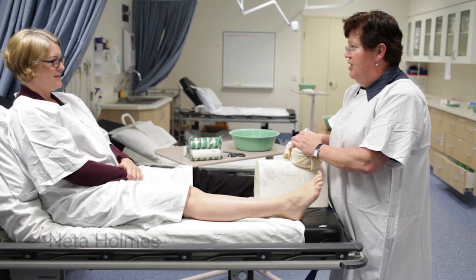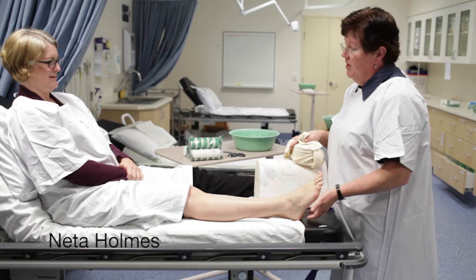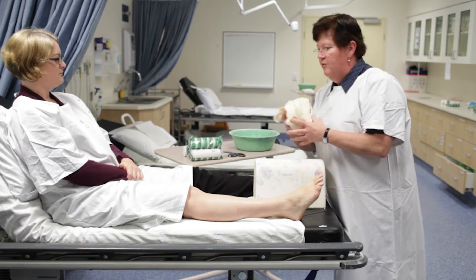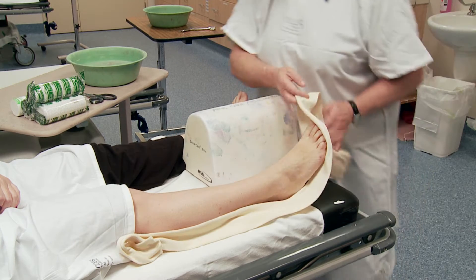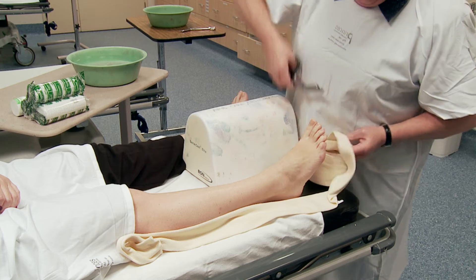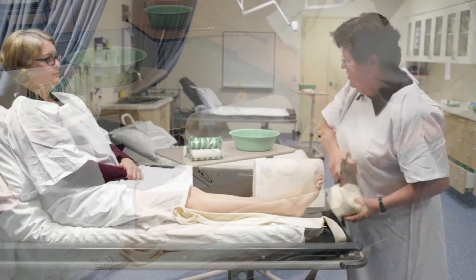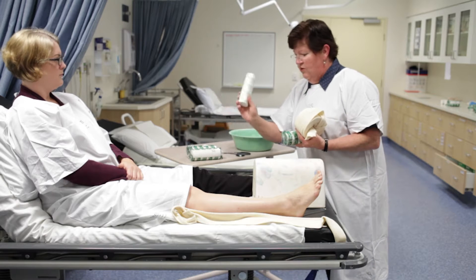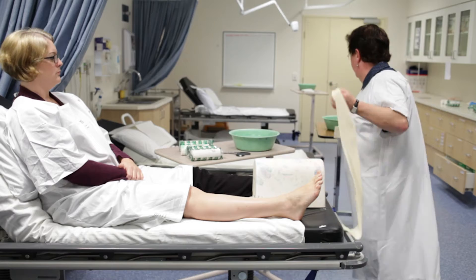My name's Nita. I'm going to put a below-knee plaster on your leg for a Weber B fracture — you've hurt your ankle. First off I'm going to measure your foot with our stocking. To do a below-knee plaster, you just need three simple things: three rolls of the 15cm plaster, one roll of the 15cm soft band, and the stocking.